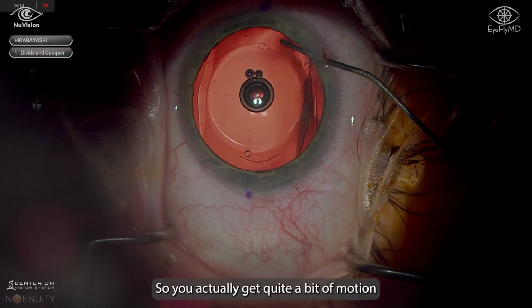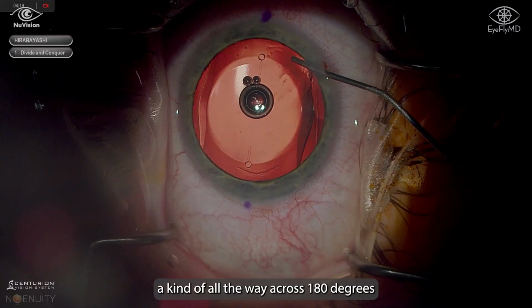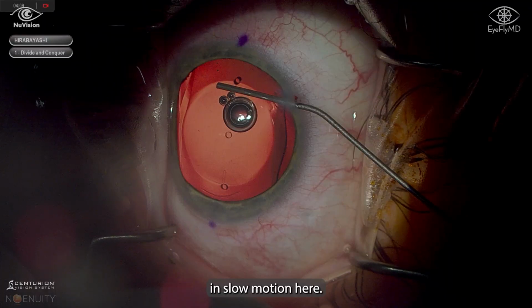So you actually get quite a bit of motion just from a little movement nasally, all the way across 180 degrees from where you're trying to spin it. Then we can just fine tune it back into the axis that we want. We'll play that again in slow motion here.